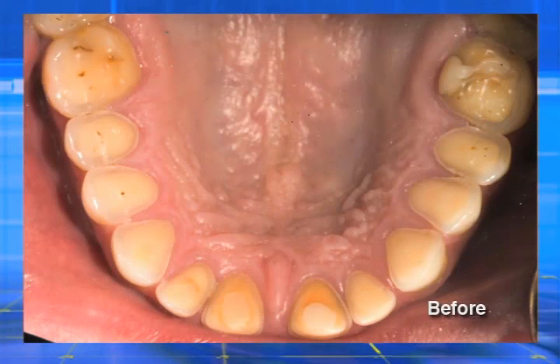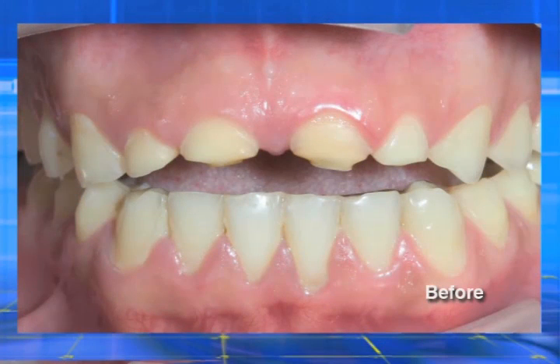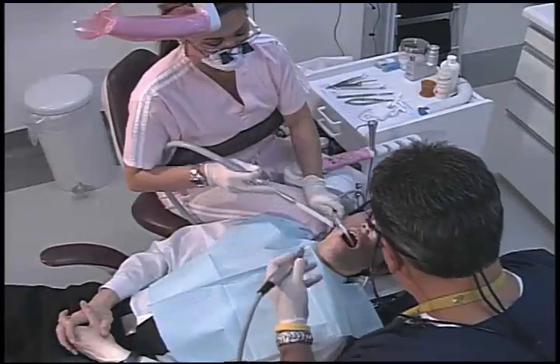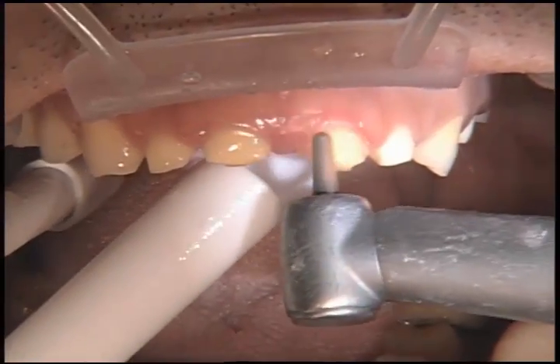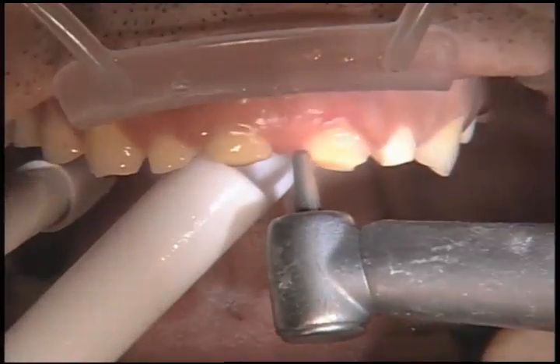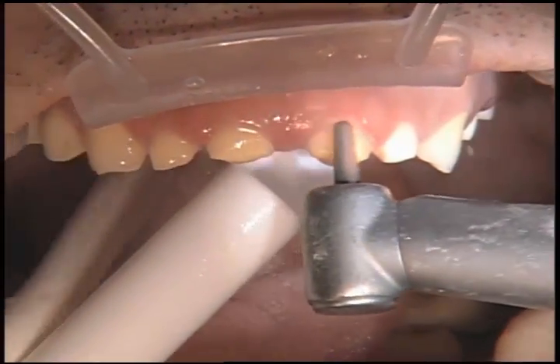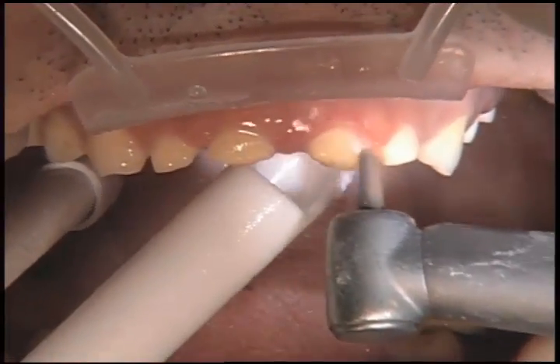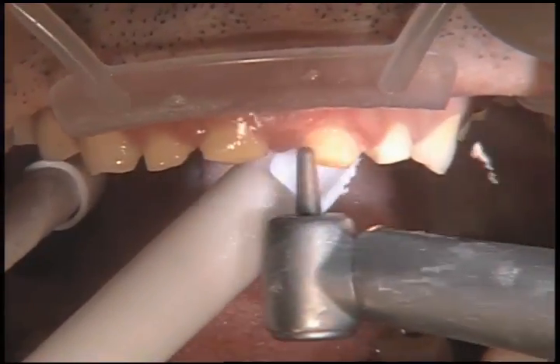He's under the care of a medical doctor who's helping him control the situation, but we know that even though the stomach acids will attack any restorations we put in the mouth, we're better off having the acid attack those restorations rather than what's left of his teeth. So this is going to be essentially a full arch case. We're going to leave one or two teeth unprepared in the back — the second molars — for the time being, because they're in pretty good shape and they'll help us maintain vertical dimension. Not a lot of preparation to be done on the anterior teeth, certainly no incisal reduction.